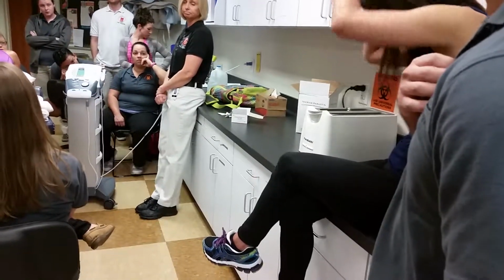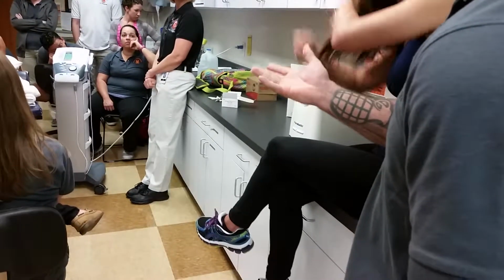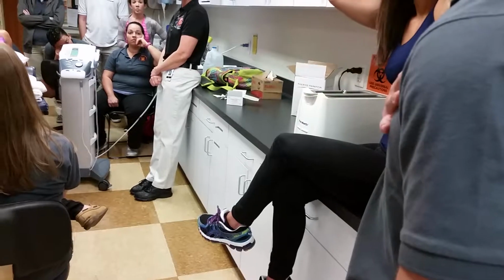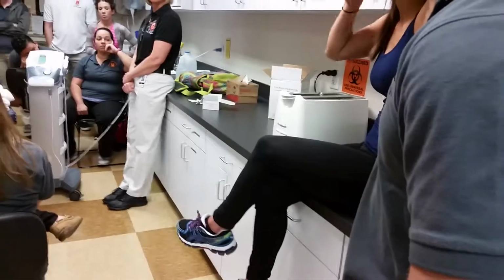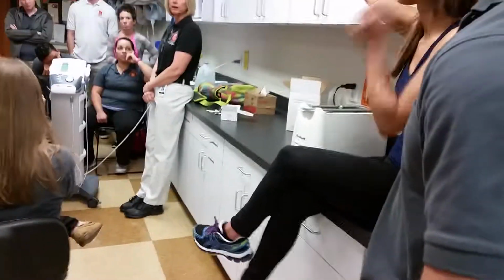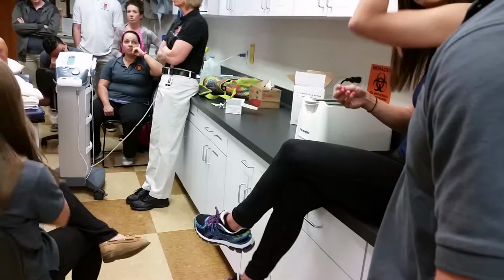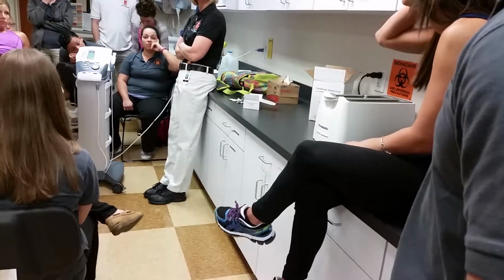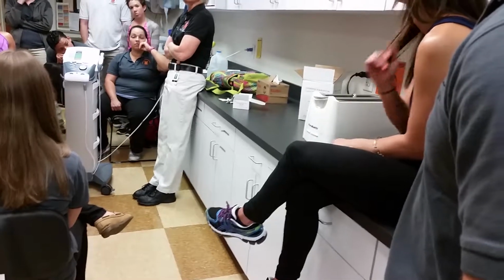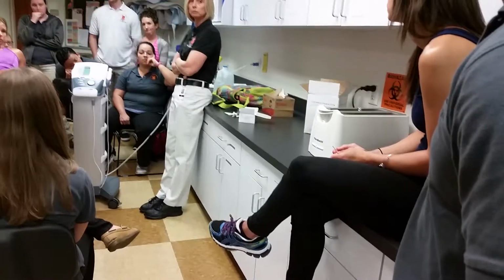Would it be safe if I see a scar and I ask them, and they know they had a knee replacement or something, and I didn't feel comfortable, if I just stayed away from doing that? Yeah, I would just get on the horn and call the therapist and say, hey, they're telling me they had a joint replacement. They don't know if they had cement, usually a knee is press fit, but they don't know. So, what do you know? The therapist may know, or if they don't know, then don't do it. Just skip that part of it until you can clarify.